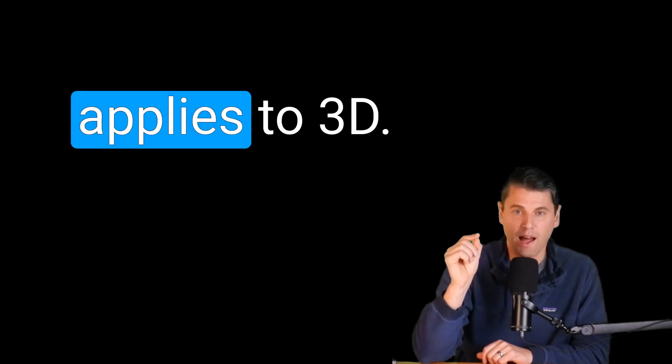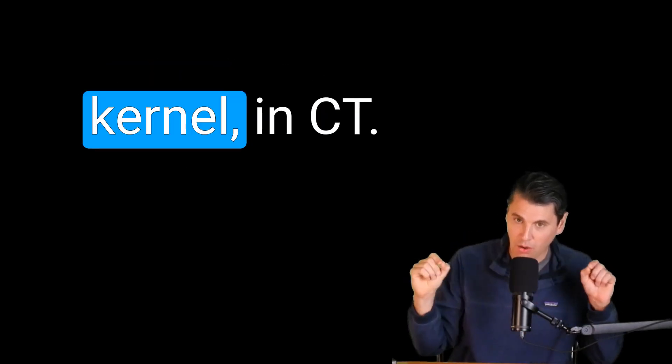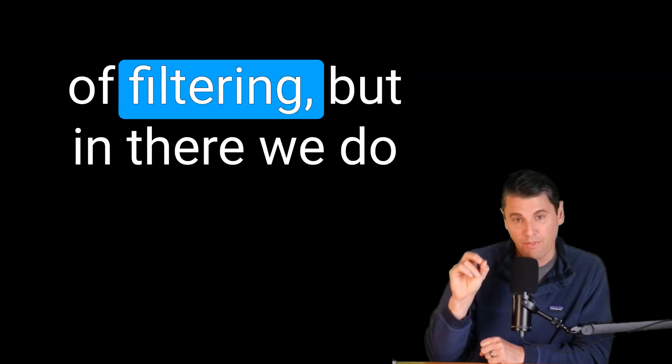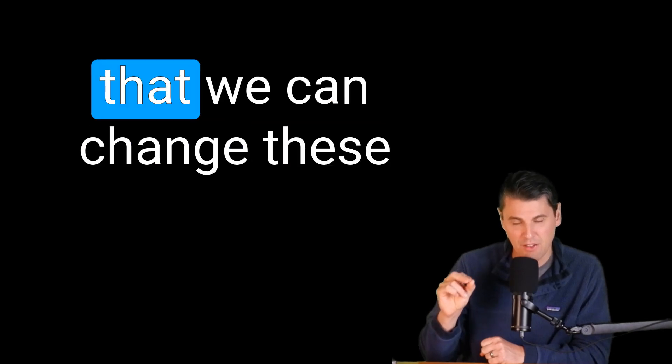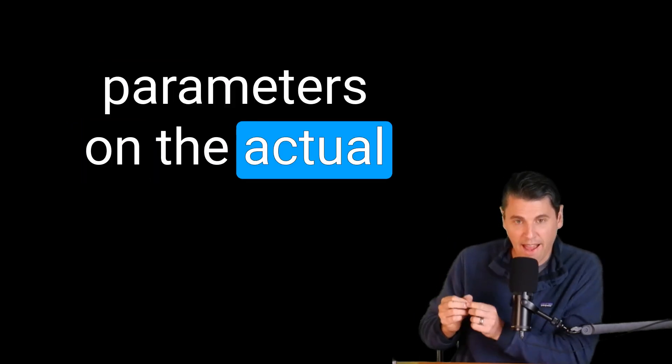Next, see how that applies to a 1D, what we call kernel in CT. We want to get the same kind of filtering, but in there we do it on the data space such that we can change these parameters on the actual raw data. When the image comes out, it's going to have these different inherent properties. Coming up next at How Radiology Works.